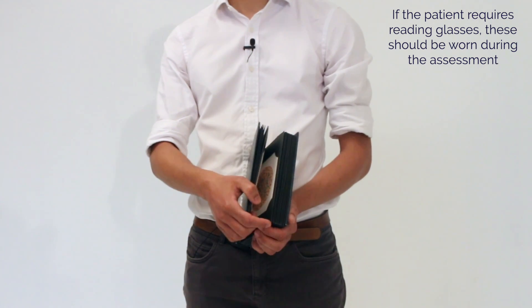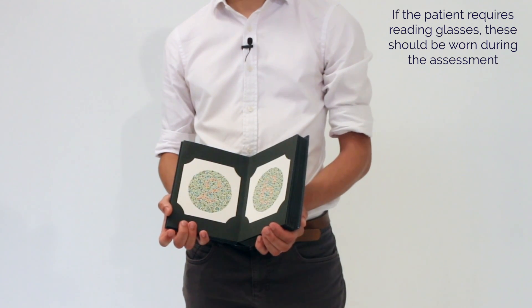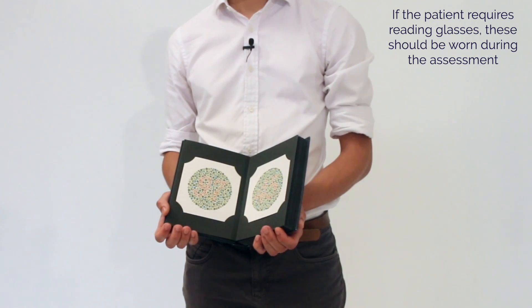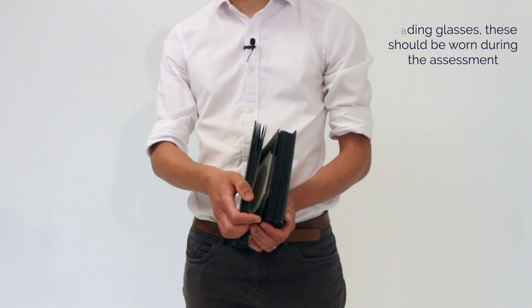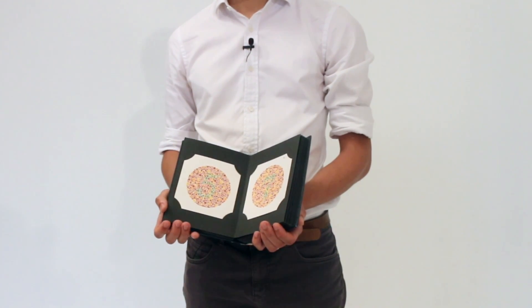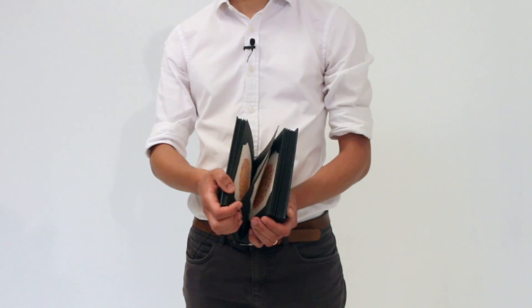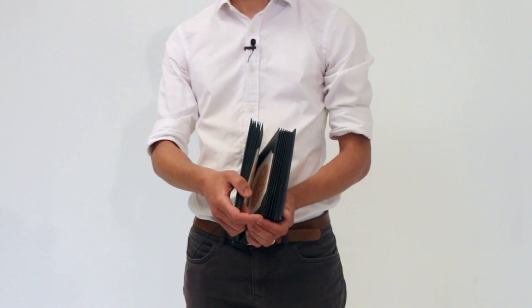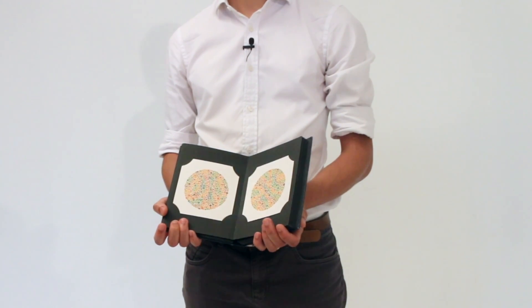74, 2, 6, 97, 45, 5, 7, 16, 73, no numbers.